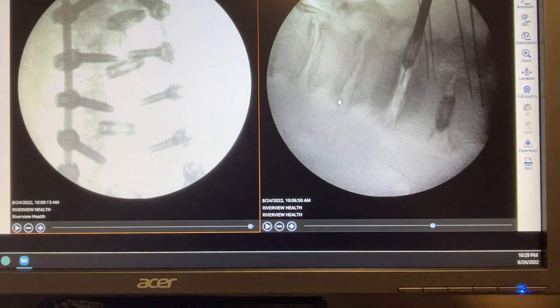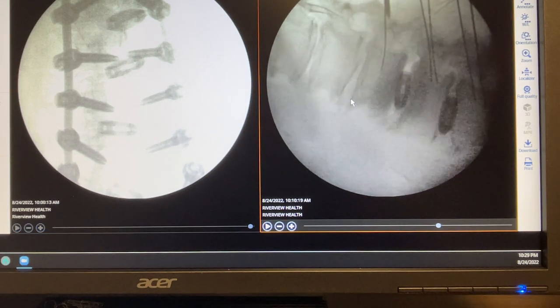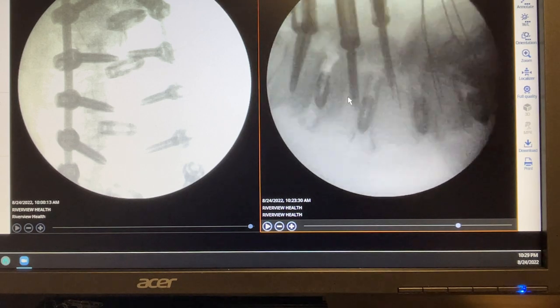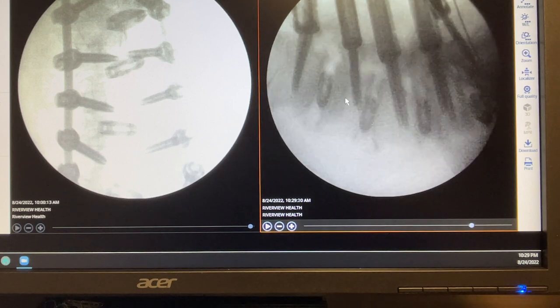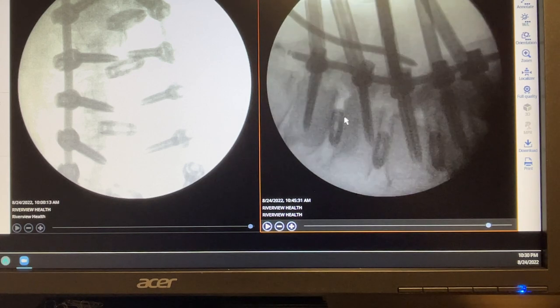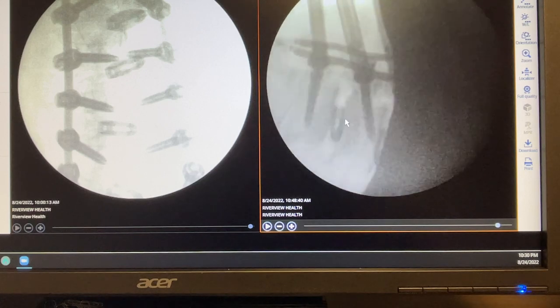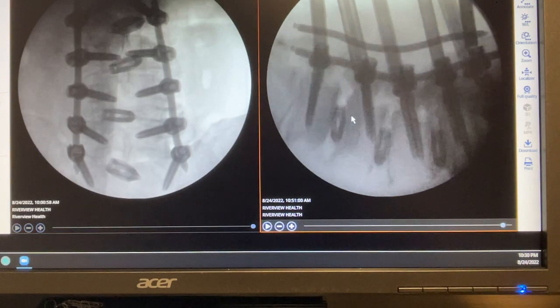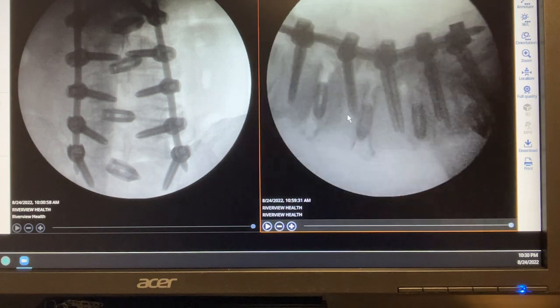At this point we take the AP machine out and the rest of the surgery is done in the lateral view. We decorticate, put the screws in, put a special bend into the rod, and lock it in place. This is the end result. This surgery was extraordinarily long compared to other four-level cases we do — but it is exactly two hours after the skin incision, with just a few more minutes needed to close the skin.